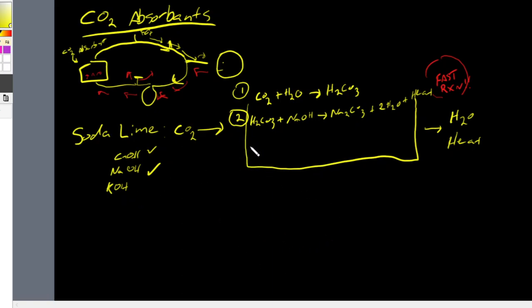So our sodium carbonate, Na2CO3, will combine with our calcium hydroxide, and that will form, to make it accurate, it's actually Ca(OH)2, just given the charges and the stoichiometry.